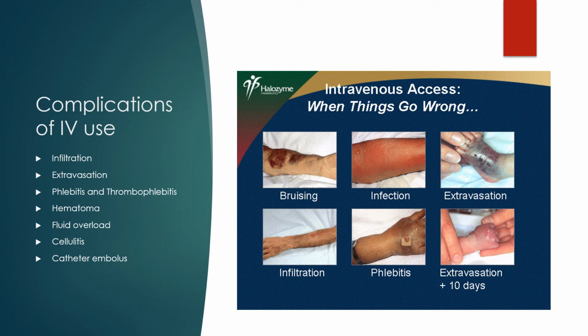All right, so let's move into some complications associated with IV therapy. What you need to understand is how to assess them, how to know if it's happening, and if you do find it, how do I take care of it if it develops? So we want to talk about prevention. How can I prevent any of these from occurring to our patient?